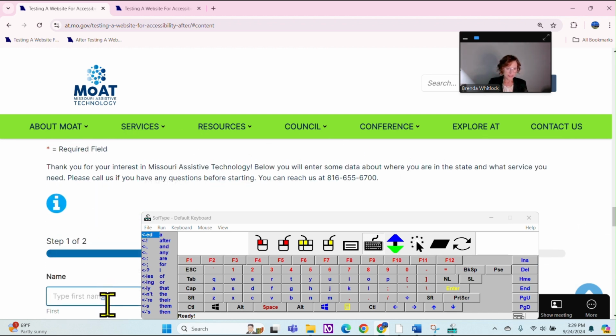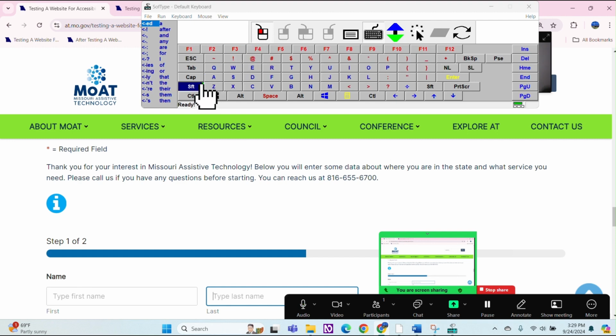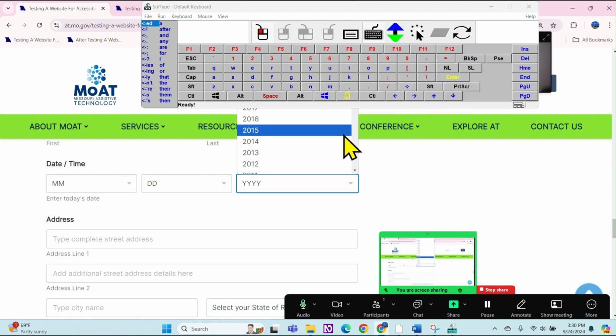And we're going to left click, and it shows you in the frame. And we're going to dock this to the top. Do a capital, so we do the left drag to do Shift W, and then hit tab and tab, and we're going to tab through these. On our year, we're going to select this and see how you do a drop down with this.